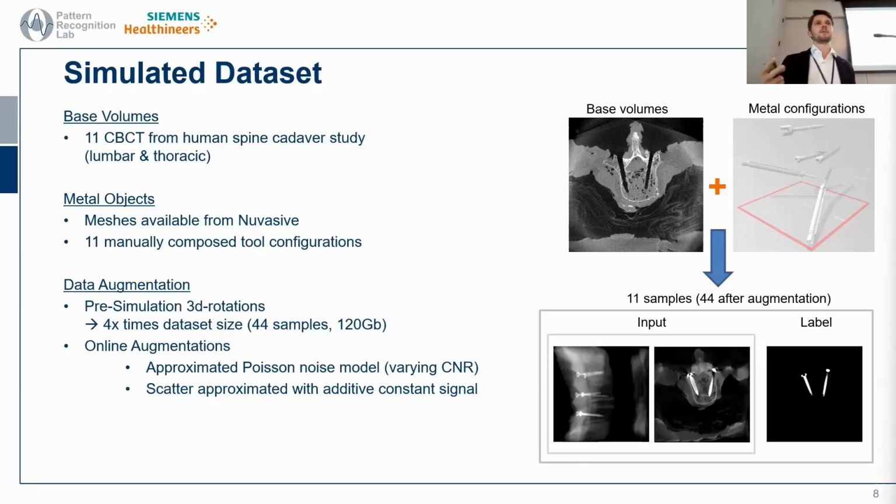Noise and scatter are also really important to simulate, and we take care of that by integrating that during the training as an online augmentation with varying levels of noise.